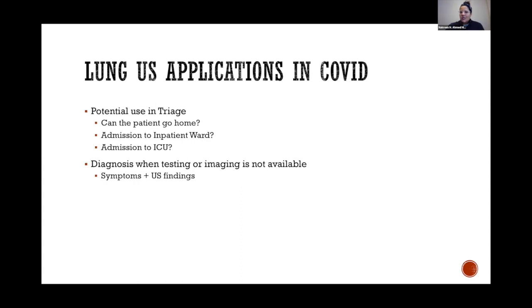If testing is not possible, I can tell you one of our Ultrasound POCUS colleagues in Baltimore, Dr. Gigi Liu, is doing lung ultrasound on patients that are false negatives or thought to be highly suspicious of COVID, but their test was negative. She is finding that that's very helpful to help increase the suspicion of whether the patient has COVID. Now, the last thing I didn't mention on here, but is still quite controversial, is whether or not lung ultrasound can be used in the process of weaning patients from a ventilator. This is still a really controversial area because we just don't know the answer to that.